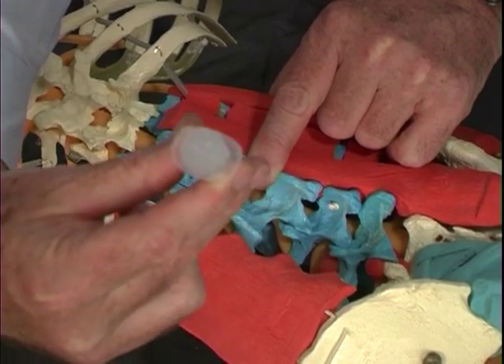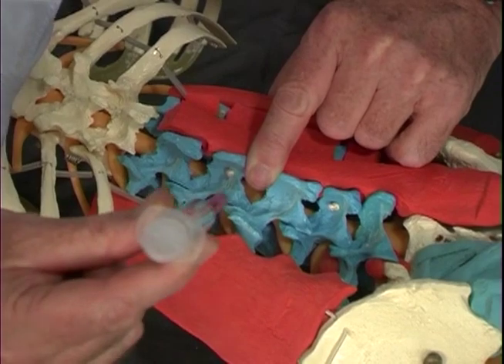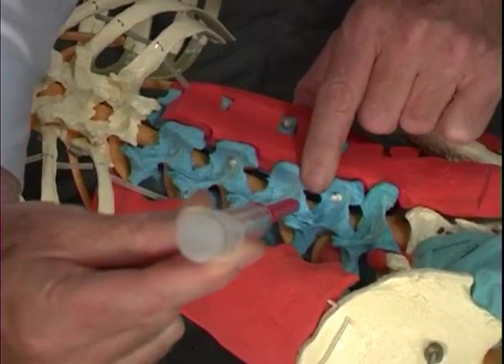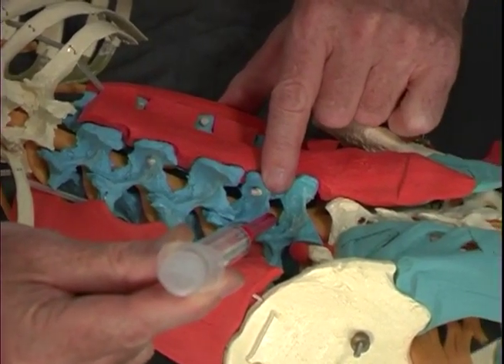We're not getting into the joint itself, unless we're very lucky, but we're hitting the capsule area around the joint. Coming down, hitting it, coming down to our next level, and hitting that area again.